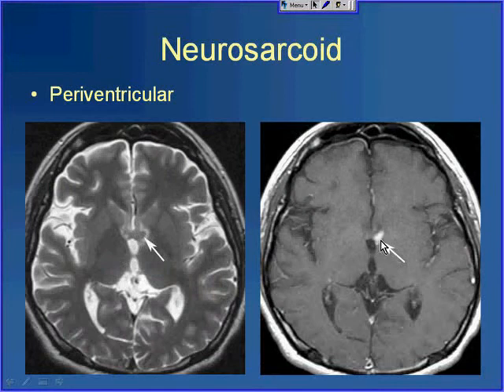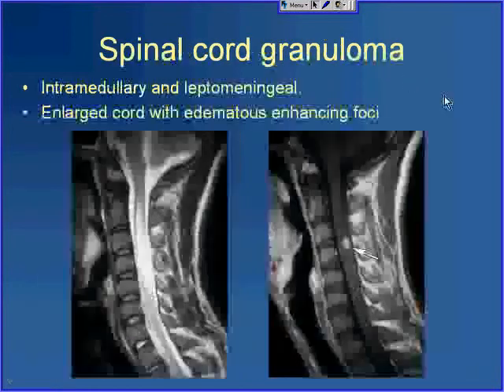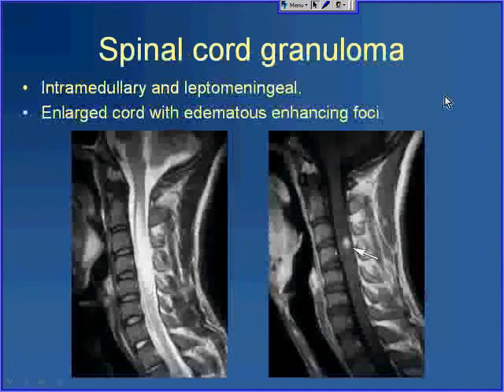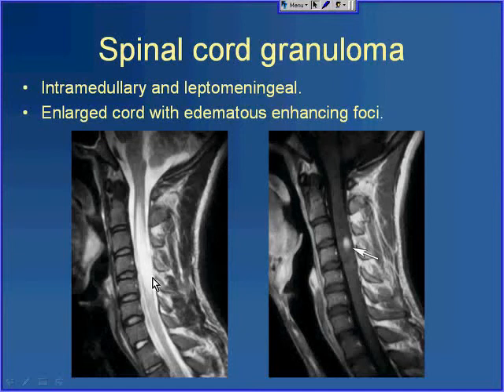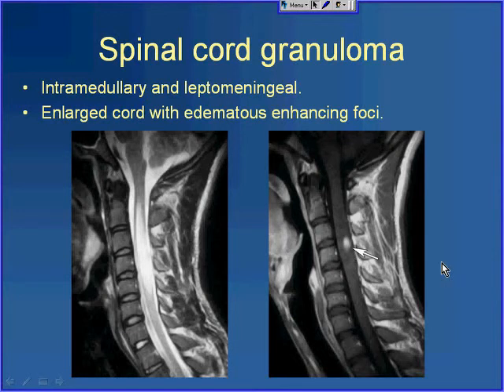On post-contrast T1, you can see the lesion is enhancing. Spinal cord involvement can also occur — either leptomeningeal involvement extending into the spinal region, or actual involvement of the cord itself. Here we have a T2-weighted image where the cord is expanded and very hyperintense, corresponding to edema. On post-contrast T1-weighted images, you can see a small nodule of enhancement. Sarcoid would not be the first thing you'd say here, but it is in the differential.